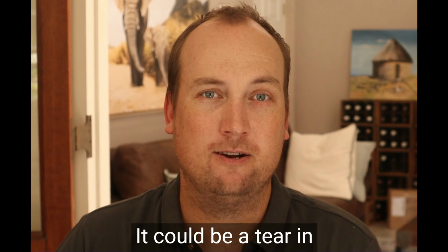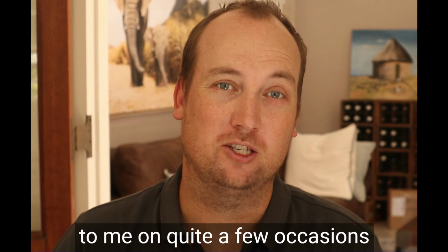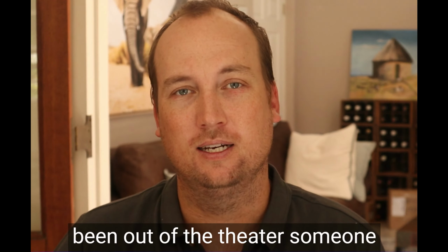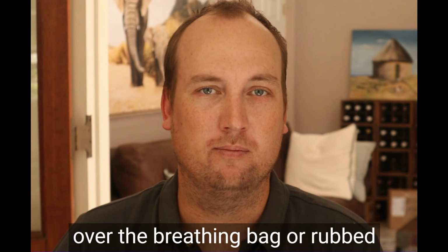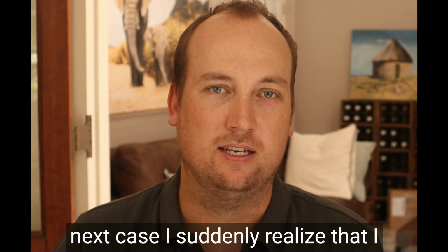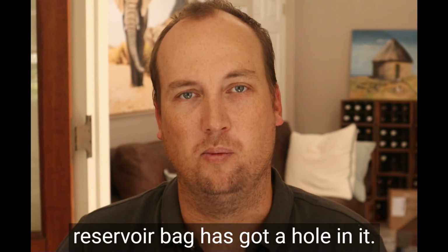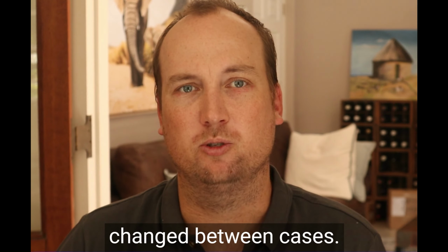It could be a tear in the reservoir bag, and this certainly has happened to me on quite a few occasions where, between cases while I've been out of the theatre, someone has moved a piece of equipment over the breathing bag or rubbed up against it and torn a hole in it, and then in the next case I suddenly realize that I can't ventilate and it's because the reservoir bag has got a hole in it. One can also have leaks from the soda lime if it's been recently changed between cases.